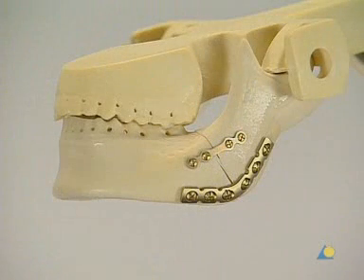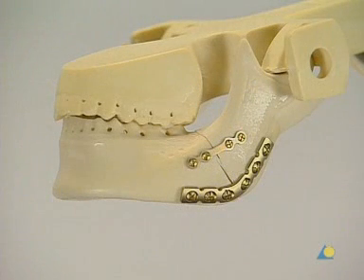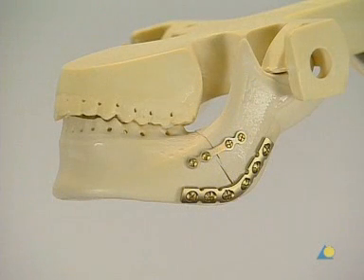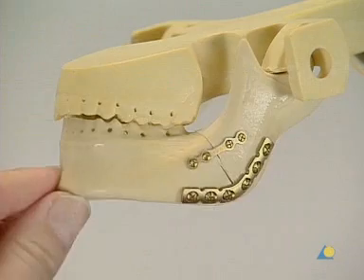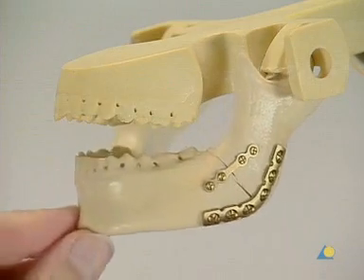The Ernst ligatures are removed. The mandible is now functionally stable.